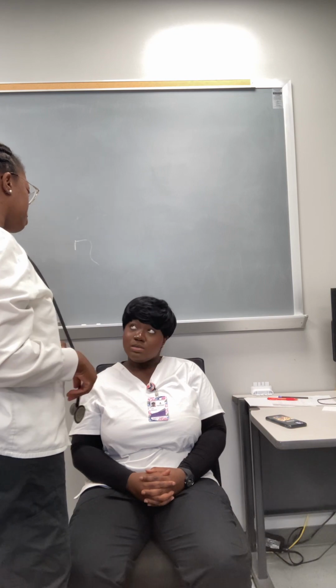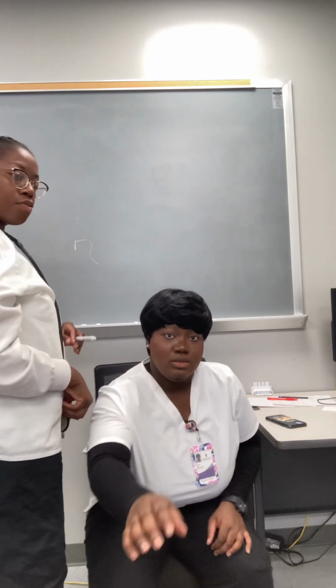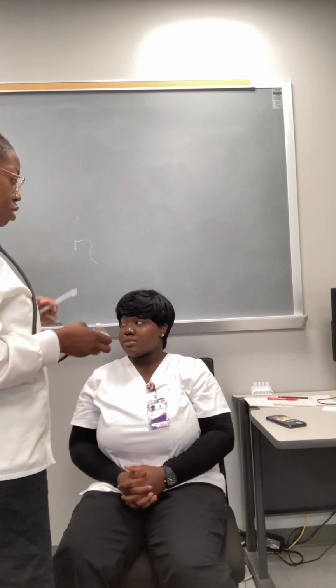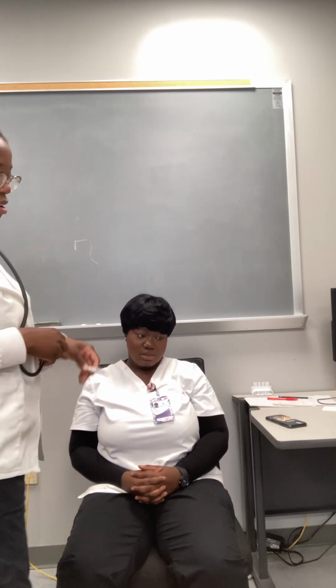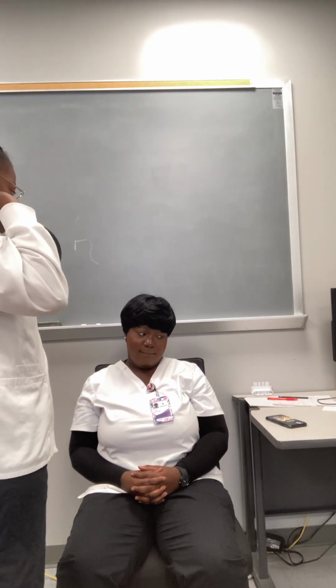Have you ever experienced chest pain? No. Okay, so for the purpose of this video, I'm going to listen over her clothes. In real life, I would listen on bare skin. So now I'm going to start listening to her lungs.